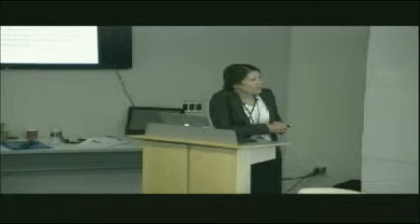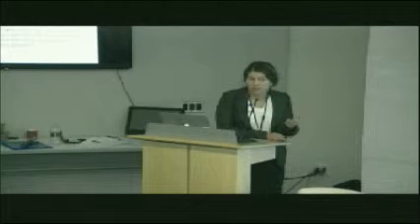Oh, sorry, not MD. So what do we hypothesize? We hypothesize that this drug, dalfampridine, will improve walking and neurologic function in patients with TM, and that the use of transcranial magnetic stimulation, see the full circle coming around, will improve our understanding of what the characteristics are for who these responders are. Because why is it only 25%? What's different about them? It'd be really nice to know that so we could just target it to those people and then be working on different medications for another group, right?